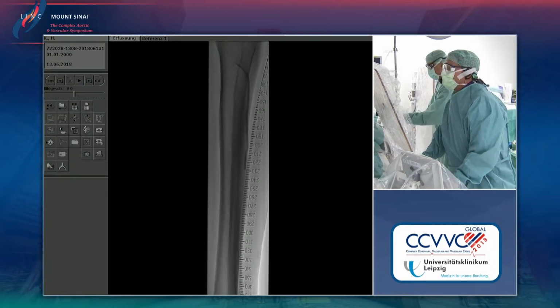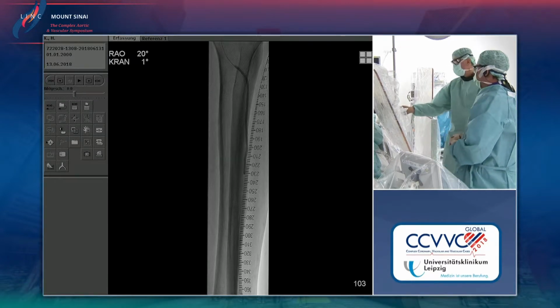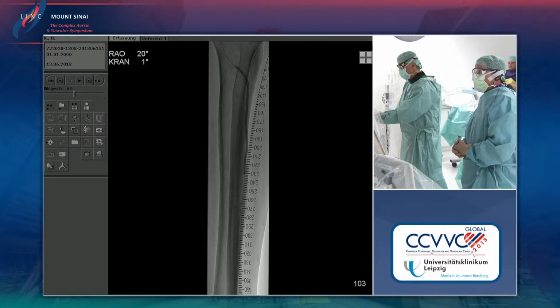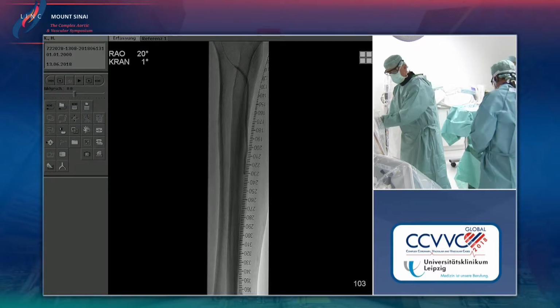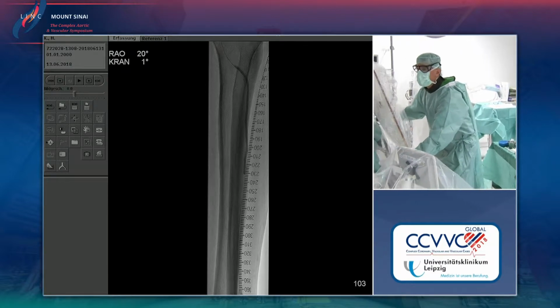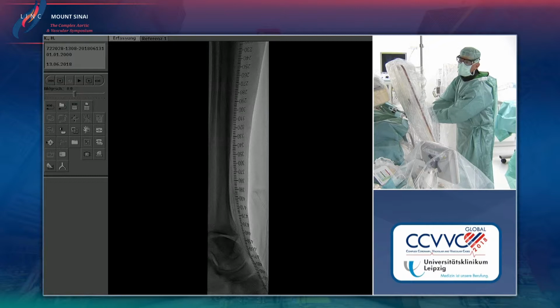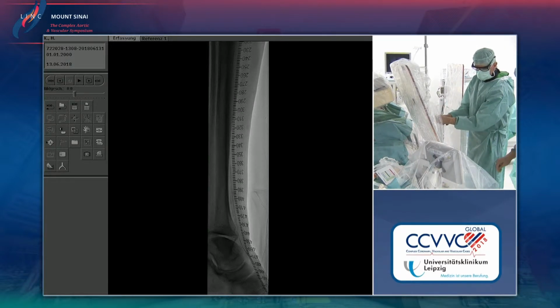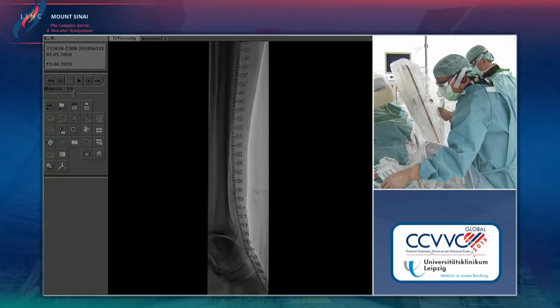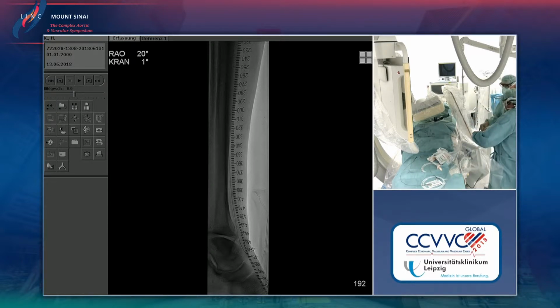There was also some concern about dexamethasone injection in patients with infection, corticosteroids having a bad impact on infections. Did you see any worsening? Because we did not see it in our cases. No, not in particular. It's unlikely that the dose you apply around the vessel has any systemic effect.